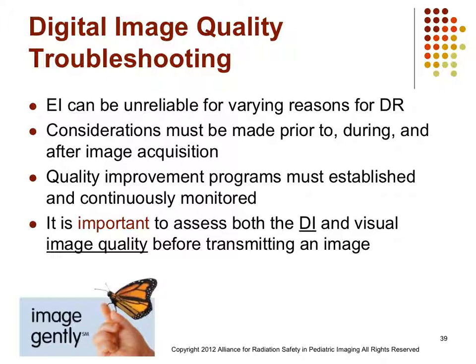So certainly considerations can be made for lessening exposure to patients prior to exposure. So whether we're talking about collimation during the exam, making sure that we're positioning our patients effectively to reduce exposure, we're using immobilization techniques, we're lessening our exposure time. Those types of things are all certainly possible. And then looking at the opportunities in post-processing to say, okay, we really don't need an additional exposure. We have everything that we need.